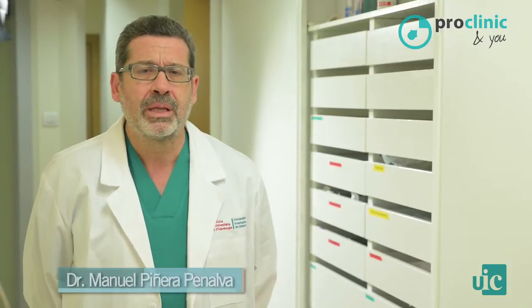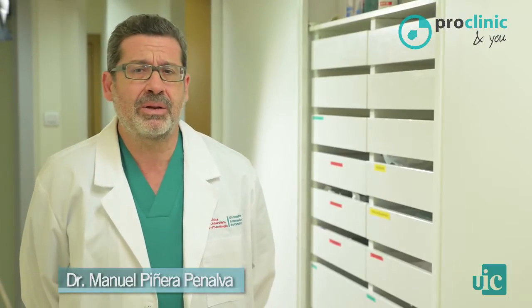Most of the dental procedures that we perform in the dental office begin with an administration of local anesthesia on the patient. This anesthesia enables us to perform any kind of dental treatment without pain sensation. Local anesthetics have evolved a lot lately, and as a result, we now have local anesthetics with a great analgesic effect that make dental treatments easier.